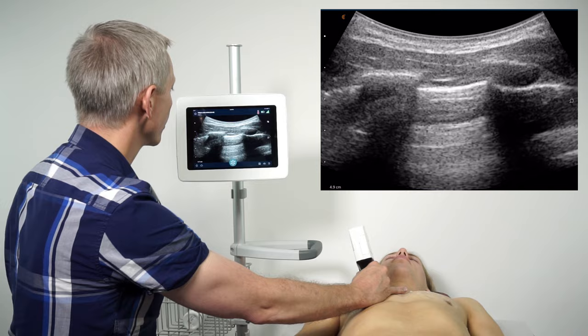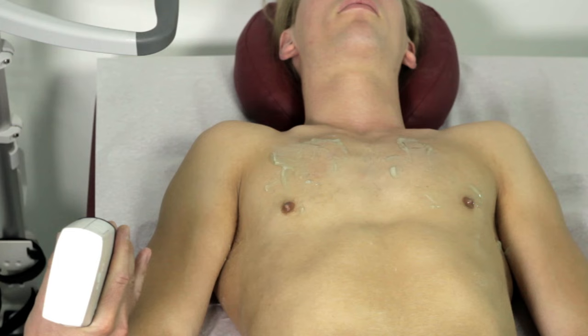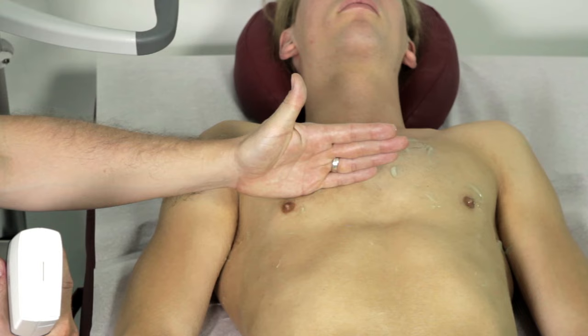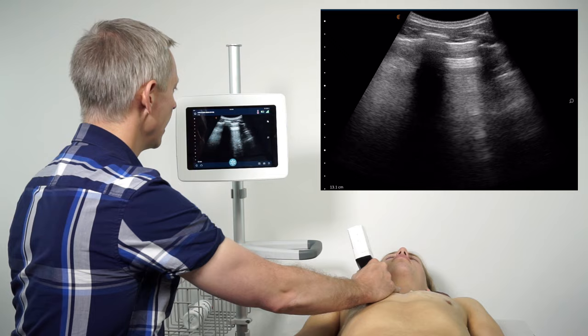I'm going to back out to about 12 centimeters and talk about a systematic approach to scanning the entire lung. The anterior chest is divided by the anterior axillary line and the sternum, and I'm going to divide that into a superior and inferior zone, with the division just above the nipple line. I'll begin by placing my transducer down in the superior anterior lung zone.